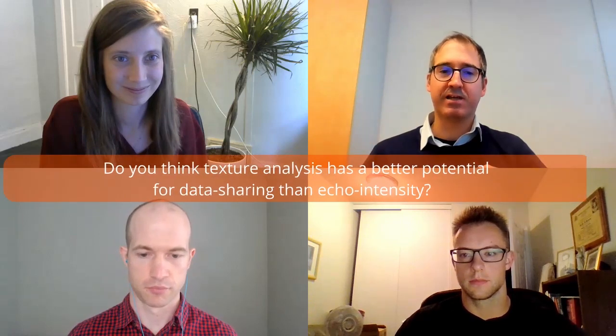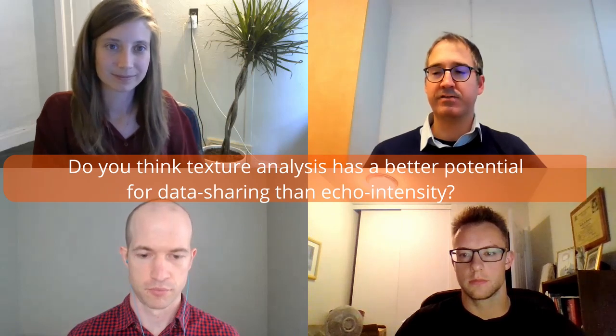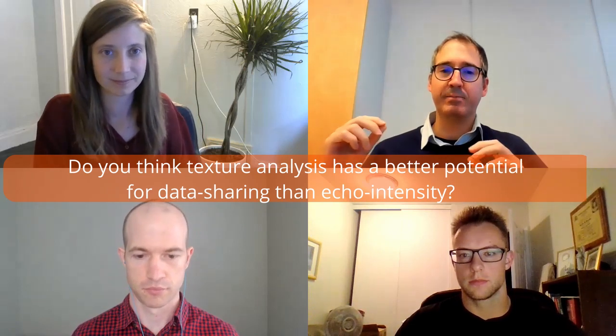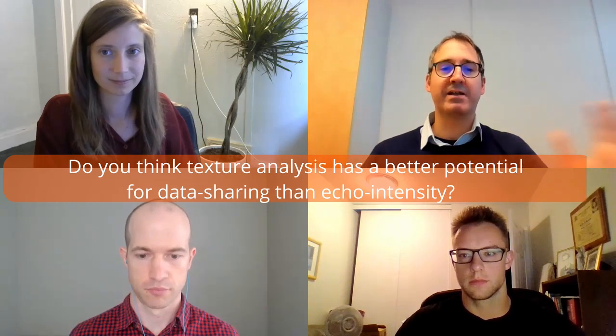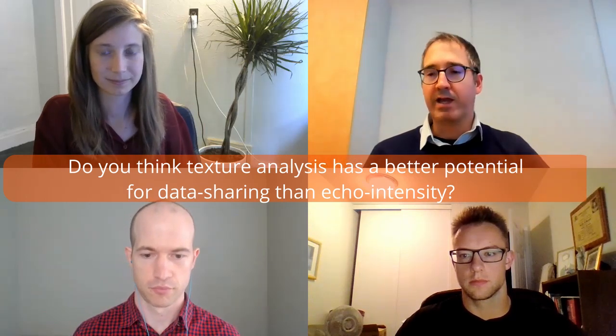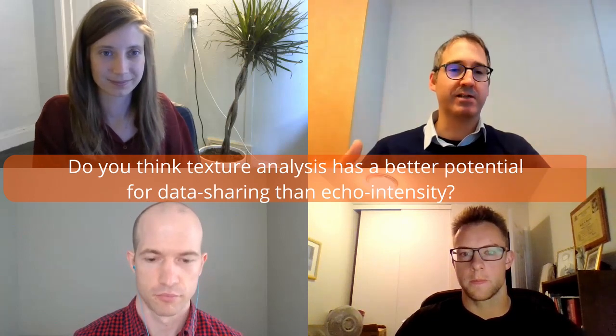Do you think this kind of texture analysis or a more advanced indicator can be much more useful than echo intensity because they are machine independent and settings independent? So then we can merge data from different centers, or if I have my data set, you have your data set, we can make an absolute comparison. It will be easier. Do you think that is one of the main advantages or not? Because I think it is.